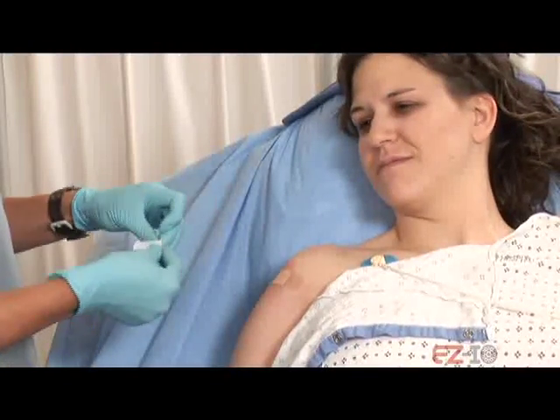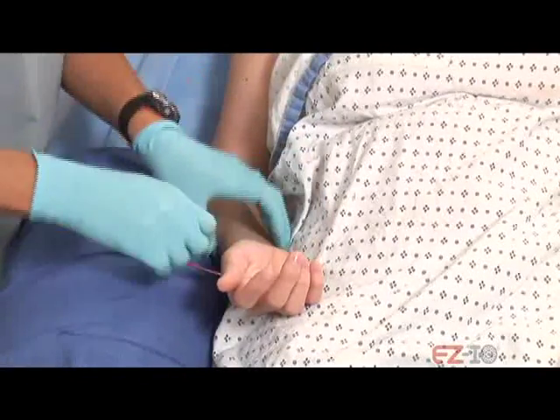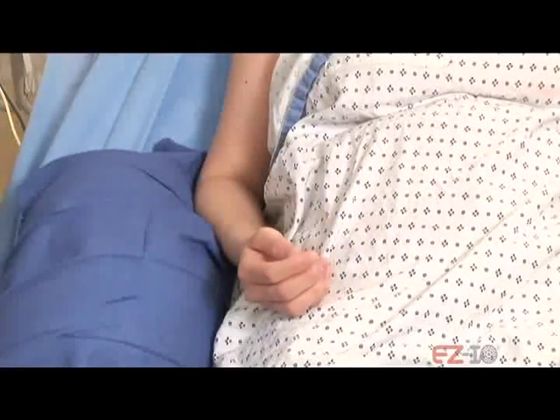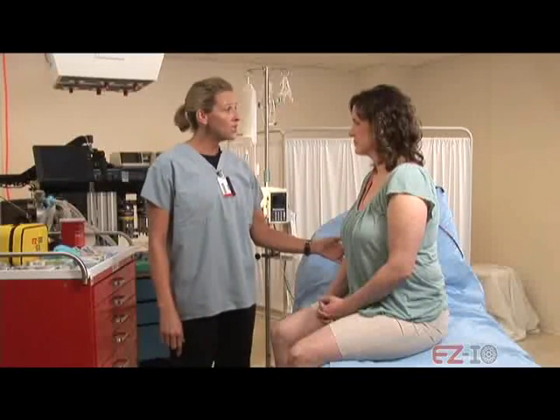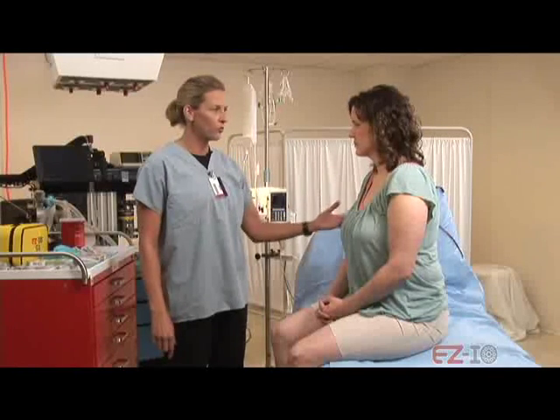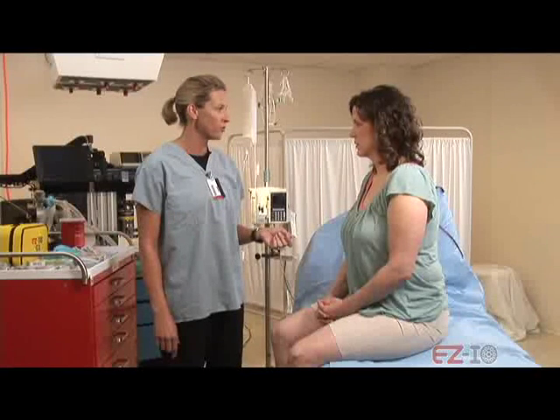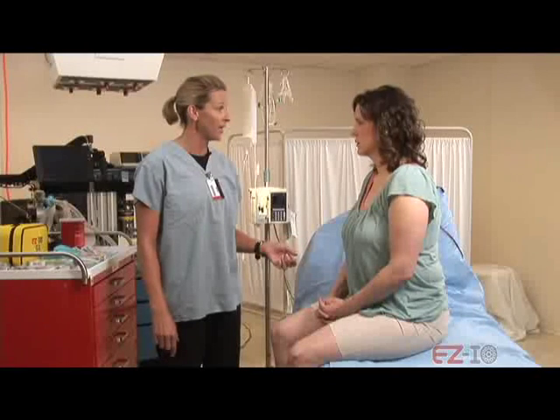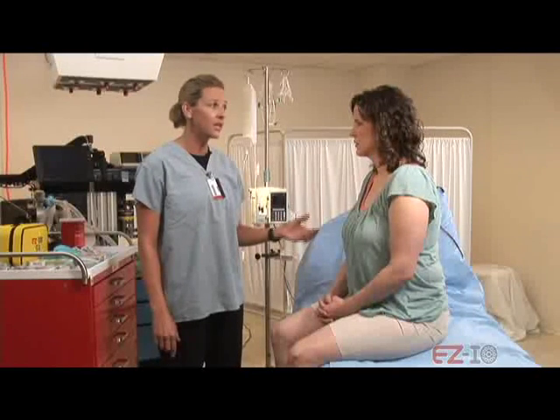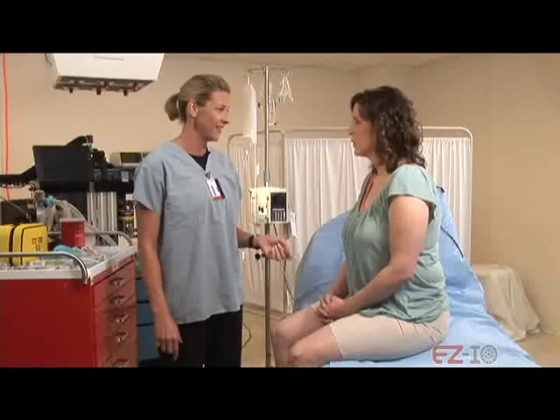Now we'll just get that wristband off you. Following removal of the EZ-IO, inform the patient that soreness is normal for up to 48 hours following removal and can be treated with over-the-counter pain medication. The patient should be able to assume normal activities as soon as their primary medical condition allows. If the patient detects any signs of infection or other problem, they should contact their primary care physician.